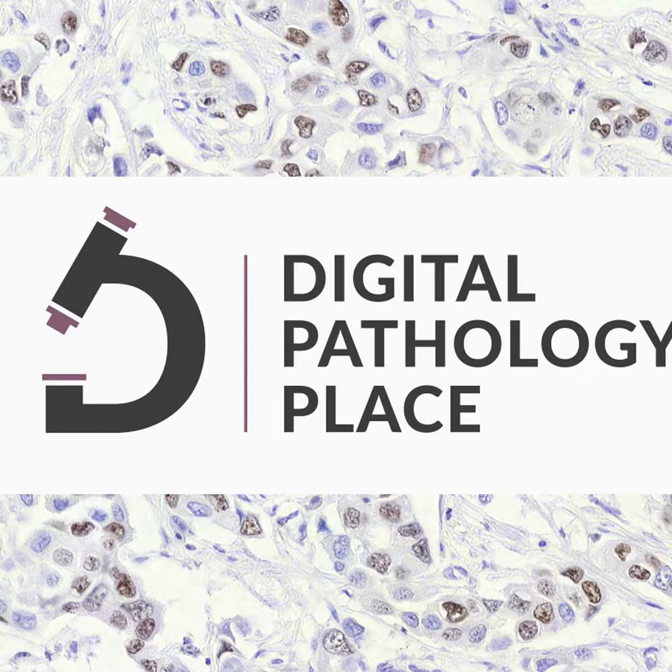how are you checking if those algorithms are good enough? You're checking against your ground truth, and unfortunately your ground truth generator is a human that is worse at the task of quantification than the computer that you're comparing them to. So that's, to me, another whole different way of evaluating this. And me personally, I think it's not being done correctly. It's not being done according to our physiological and visual strengths, but we don't have a better way to do it. And the way we do it right now visually is the standard of care.